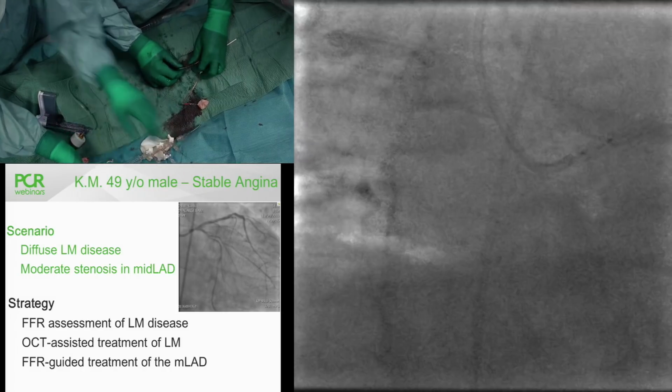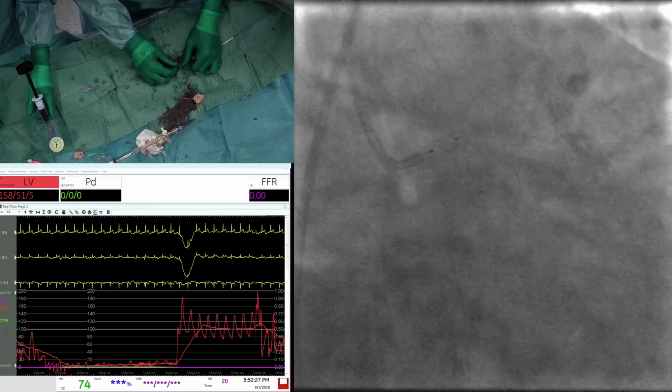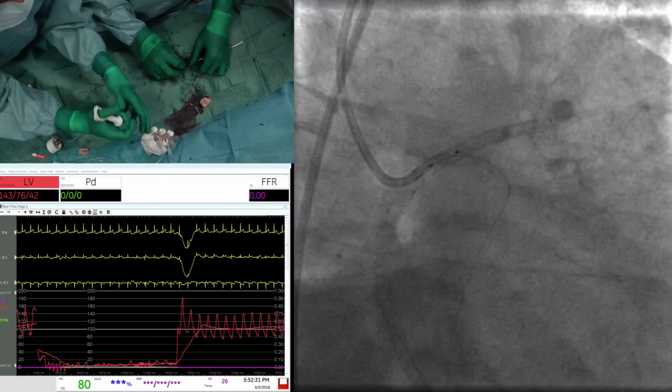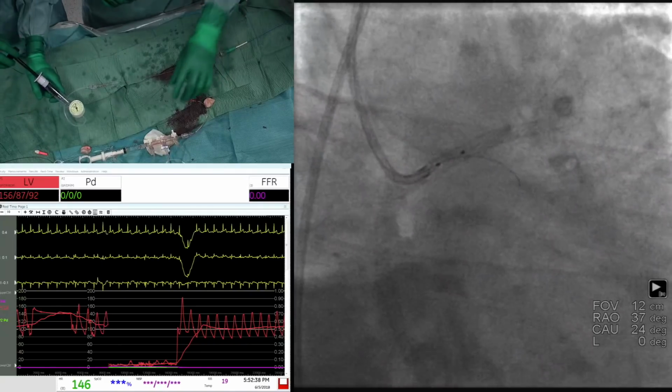And to do the POT, could you explain that? We have to put the marker where again? Yes, exactly. So the POT is performed properly if you are not going over the side branch, right? Because actually your goal, you have selected the stent according to the distal main branch diameter.